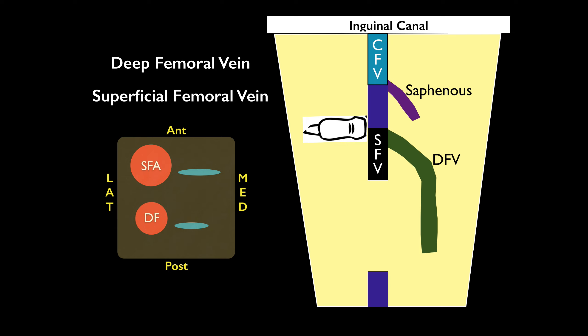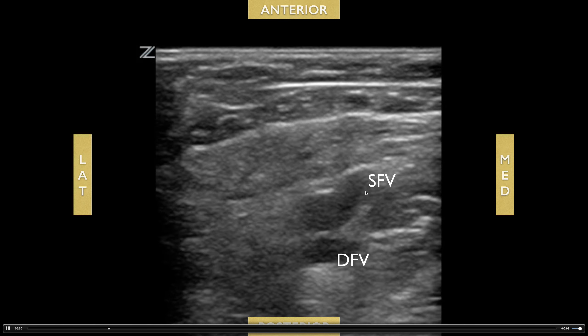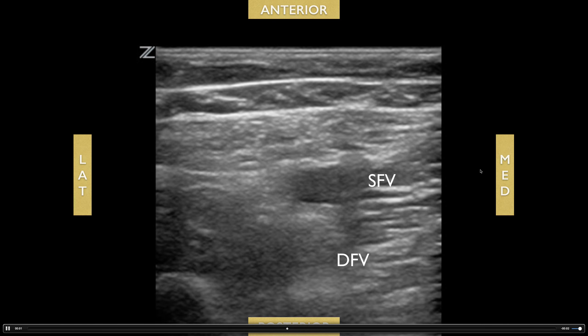It might be a little misleading — even though it's called the superficial femoral vein, it is still considered a deep vein. So if you have a clot there, it's still considered a deep vein thrombosis. Don't be confused by the nomenclature. Here's what the superficial femoral vein looks like — you can see it right there — and here's the deep femoral vein just underneath the artery. Every patient's anatomy may differ slightly, but you should see two separate veins: one anterior and one posterior, identifying the superficial and deep femoral veins.